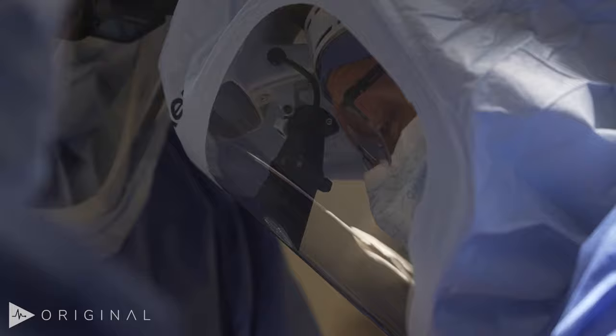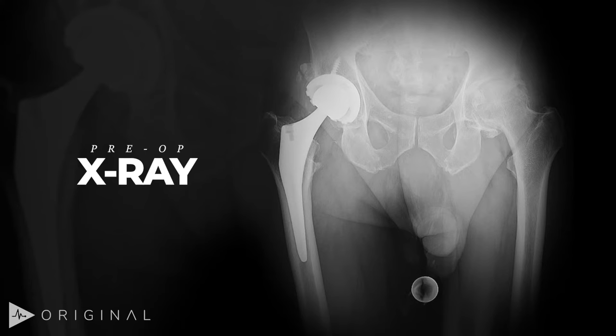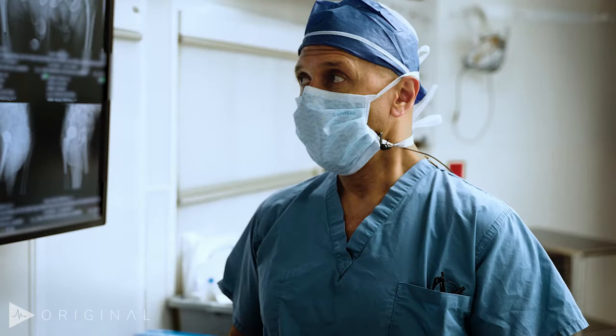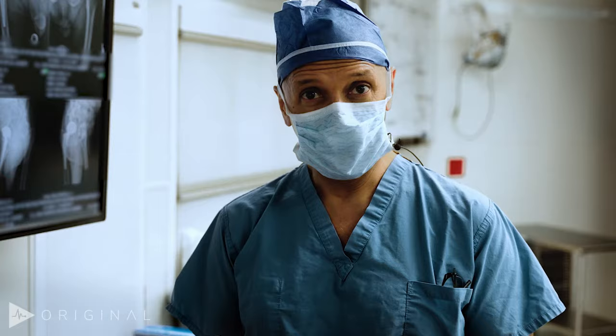This patient is a 71-year-old man who has previously had a right hip replacement done by us, and now his left hip has become his greatest limitation. Part of what we seek to do with this operation is only disturb the specific tissues that are required in order to do the operation effectively.